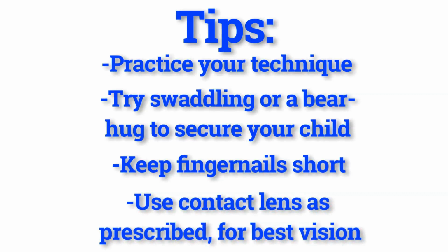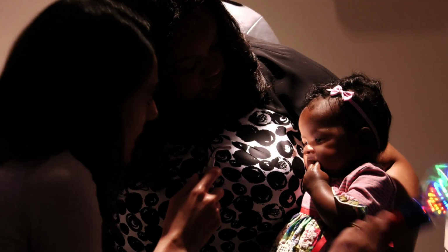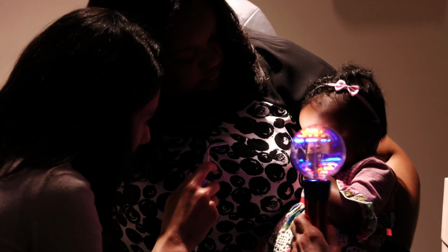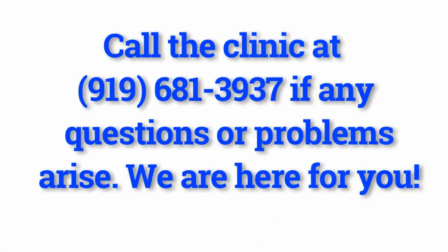It is very important that you continue using the contact lens as prescribed by your doctor. So please do not hesitate to call the clinic if any concerns or questions arise. Remember, we are here as a resource and to support you through this process.